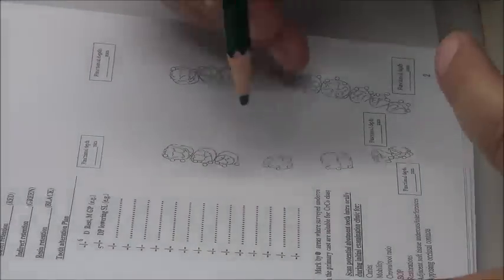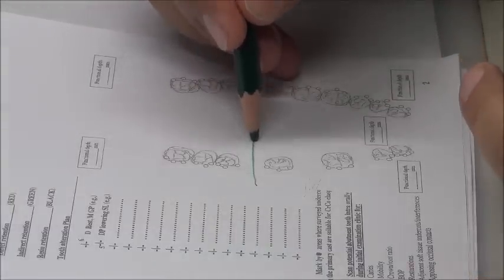Okay, let's shift to the other. What do we have in this case? Once more, the junction between the upper and the lower. We're talking about the upper now. What's the Kennedy classification in this case? Class 4. Bounded, I mean. Okay, we put class 4.